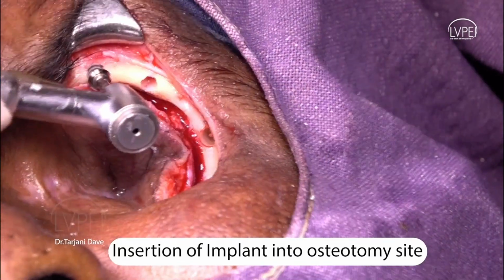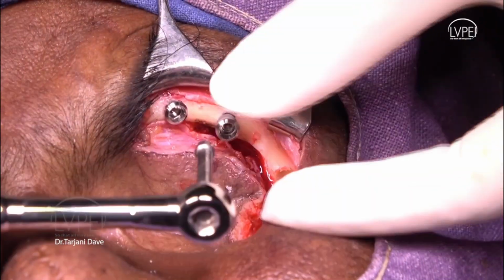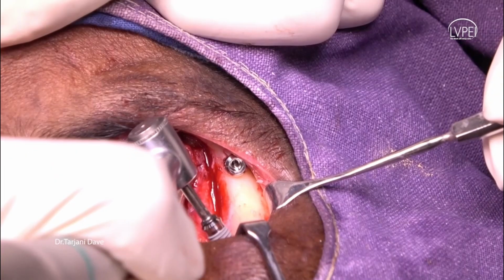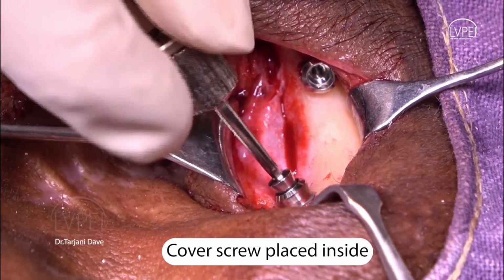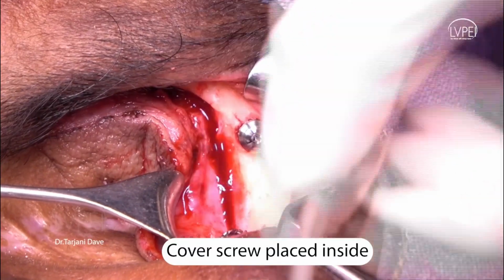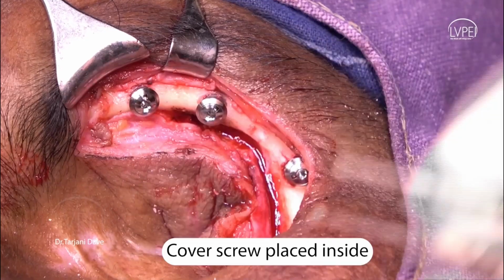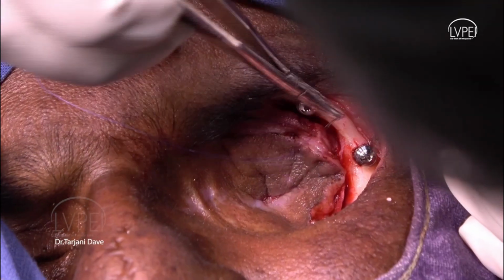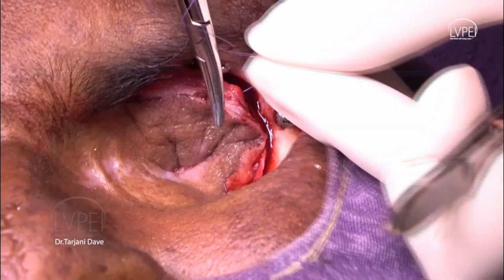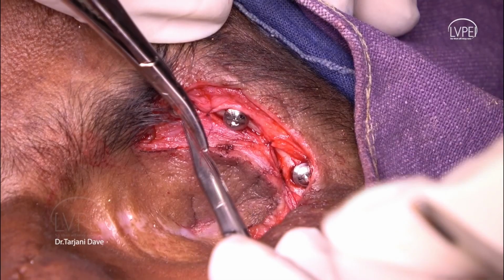Now, the implant is inserted into the osteotomy after checking its depth and trajectory. Cover screws are inserted into the implant to avoid soft tissue entrapment and epithelial ingrowth. Periosteum is sutured together with absorbable sutures and the overlying skin is closed with 6-0 Vicryl interrupted sutures.